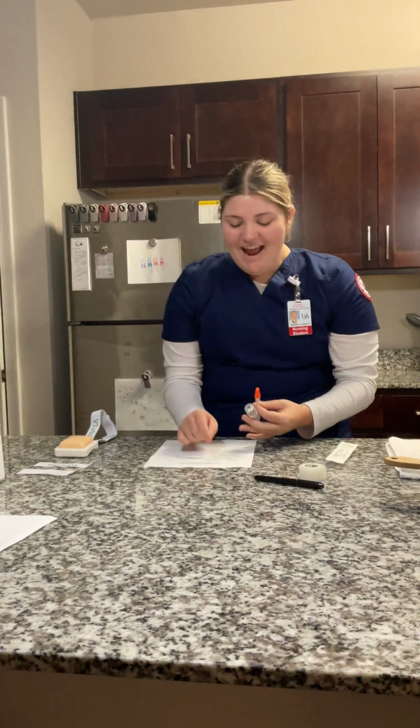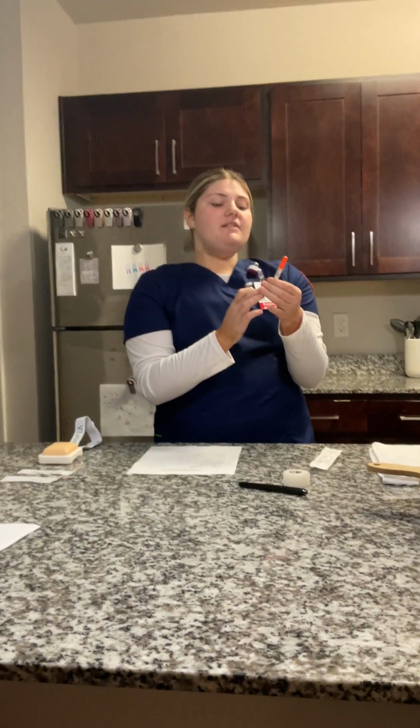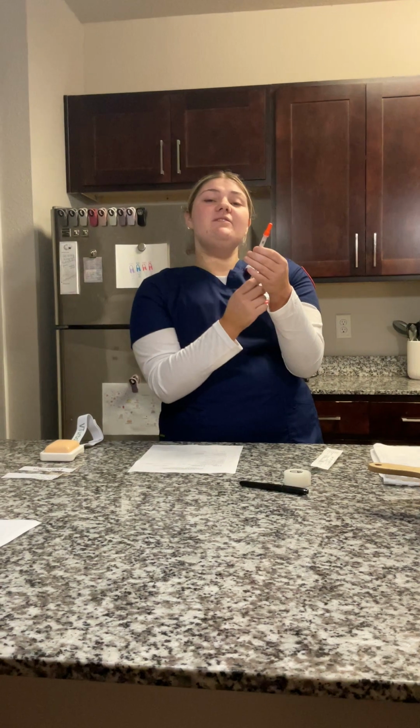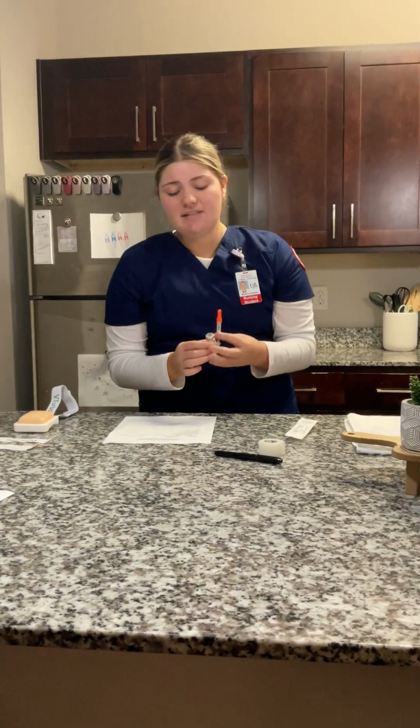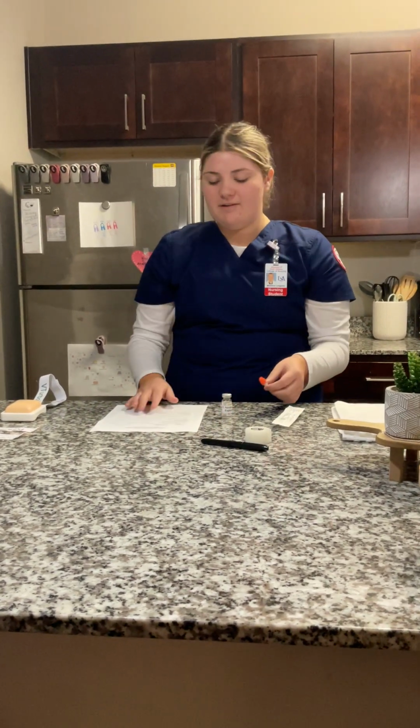Novolin R regular insulin is 10 units. So there's 100 units in my vial, but my syringe is measured in units, so I'm able to pull back 10 units of medication, and it should be the same amount, and I will get a nurse to make sure my calculations are correct. It's given subcutaneously, so insulin is a medication that you inject at subcutaneous injection sites, and my syringe is made for subcutaneous injection sites. And it's 30 minutes before meals, and so Mr. Jaguar J. Jones' next meal is in a little bit before 30 minutes, but I'm still preparing my drug.